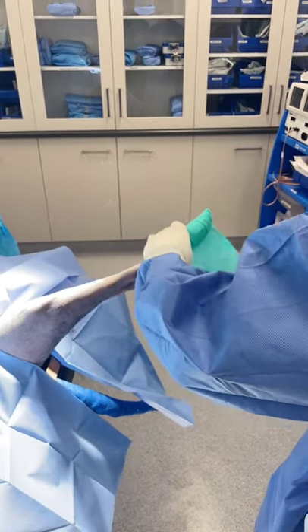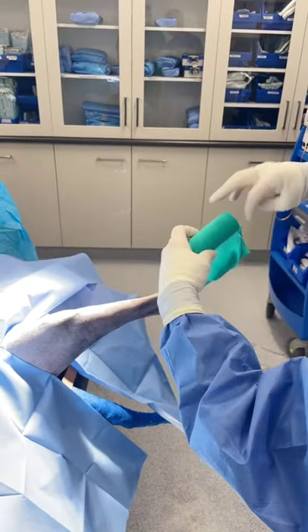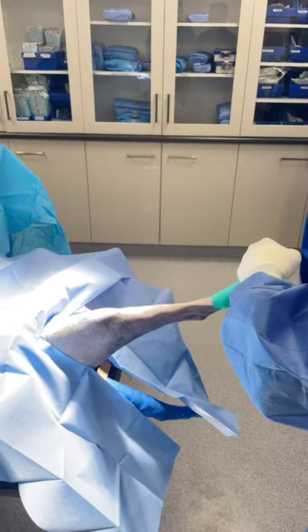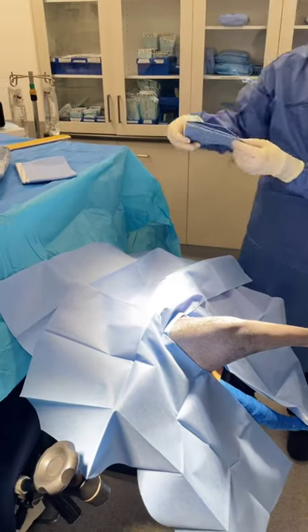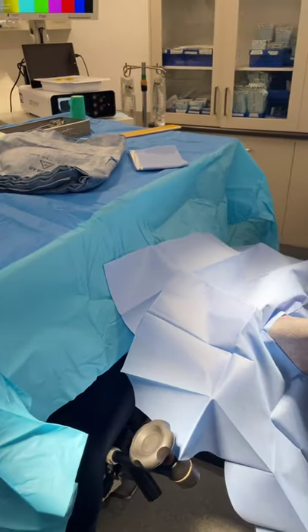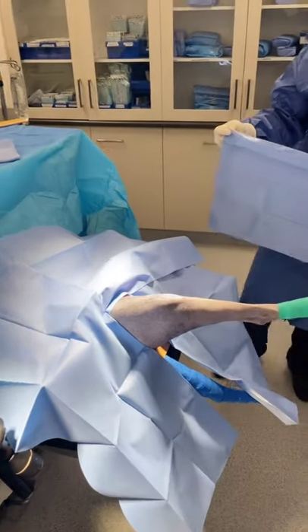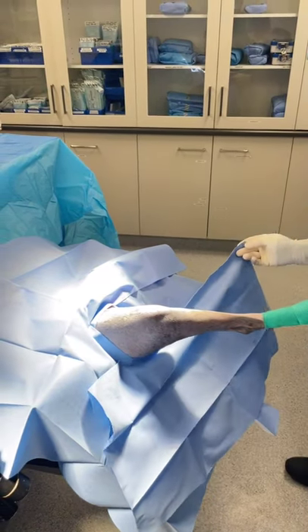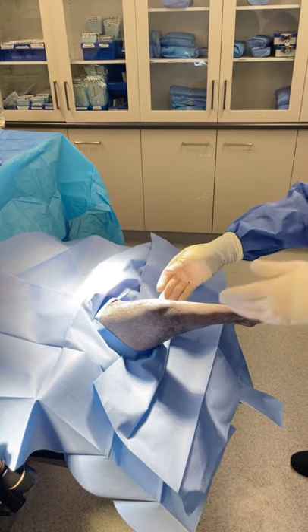We do a couple of wraps around the foot with our sterile vet wrap — no pressure Ewan, you've got to make this look nice. Once that's done, we can put our final quarter drapes on, and then the last drape will be our patient drape. You'll notice this dog is positioned on its back, and we have our surgical table sitting over the top of the dog. That makes it easier when we're standing at the back — we can reach forward and grab all the instruments we need off the table.